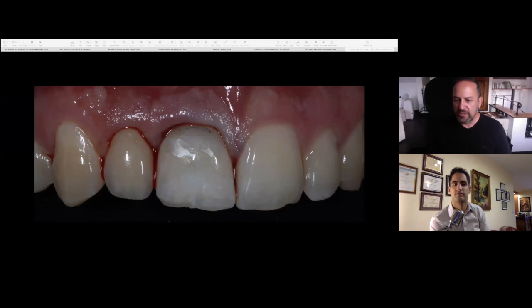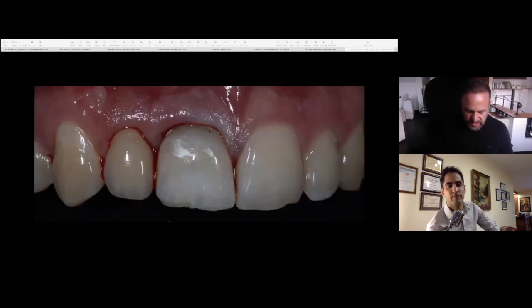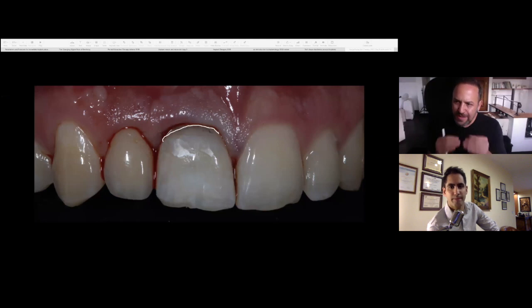And you can see how well it takes to the contour. And you can see now we've drawn a line. Can you see this little pencil line that we've drawn there? Okay. And just to say, we draw a pencil line over there. Now, the purpose of the pencil line is to mark where the gingiva sits, because we know from Sue that we want our emergence profile to only start 1 millimeter below the gum. And that is absolutely crucial, because if it starts 1 millimeter below the gum, that is going to give you your stability of soft tissue.